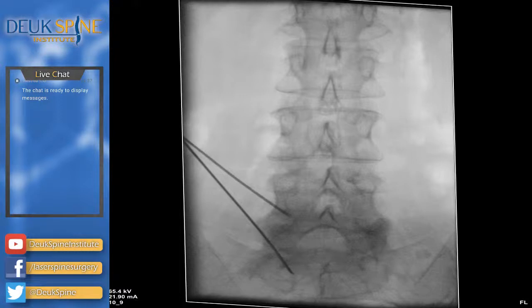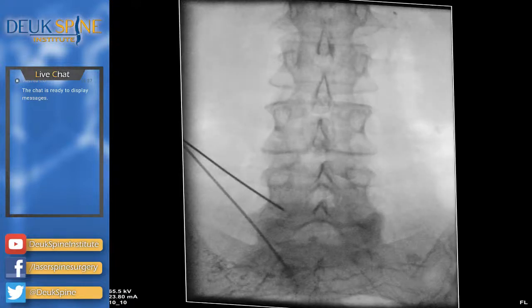Don't move around too much, okay? How bad is that on a scale of 1 to 10? 10? Is that where you get your back pain? Isn't that amazing? There's like no disc left, 99% collapse. Just relax, you're fine. I apologize. You said it was a 10? Let's go to a lateral. Once again, the dye isn't even staying in the disc, it just leaks out. That's L5-S1. So 8 out of 10 for L4-5, 10 out of 10 for L5-S1.